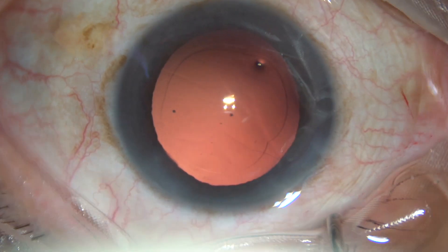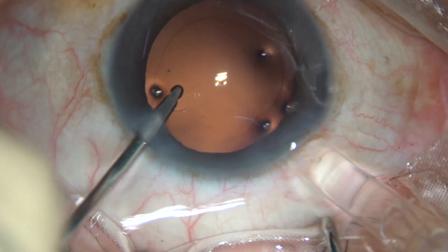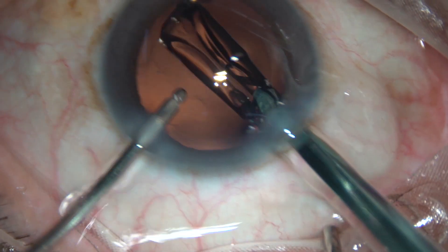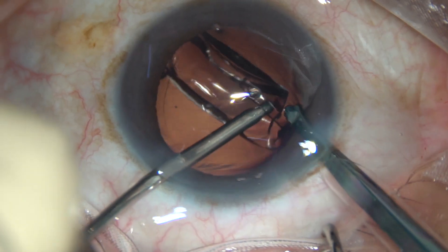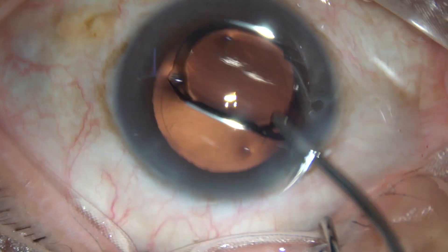And now, in this case, a hydrophobic single-piece acrylic lens is being implanted under irrigation. The trailing haptic is guided by the irrigating probe into the capsular bag.